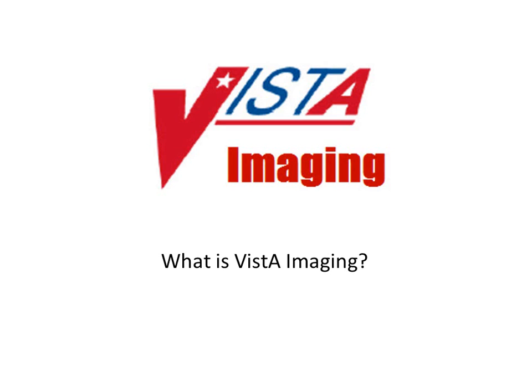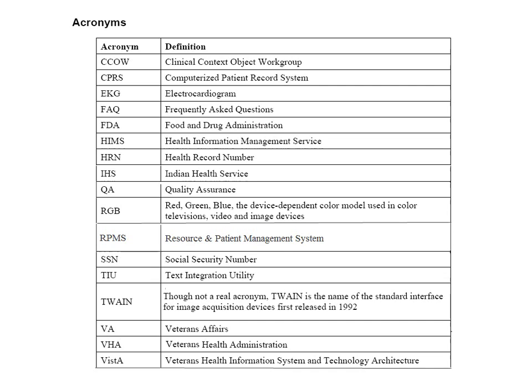It is important to note that the Food and Drug Administration classifies the Vista Imaging software as a medical device. Modifications to the computer where this software is installed, such as the installation of unapproved hardware or software, will adulterate the medical device. The use of an adulterated medical device violates U.S. federal laws as defined in the Code of Federal Regulations 21 CFR 820.